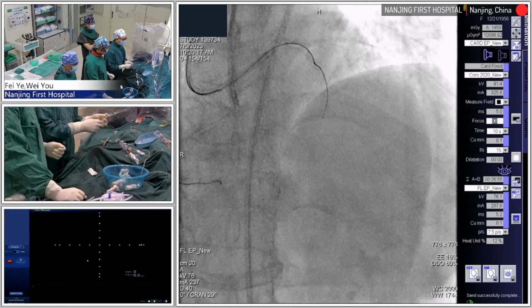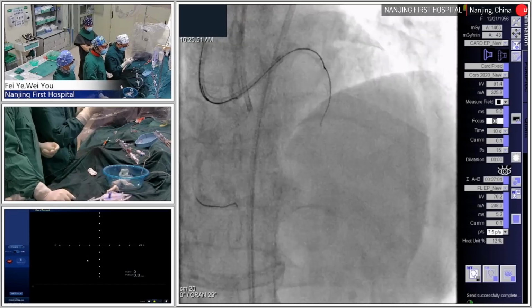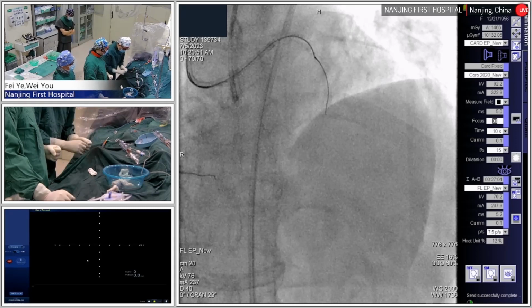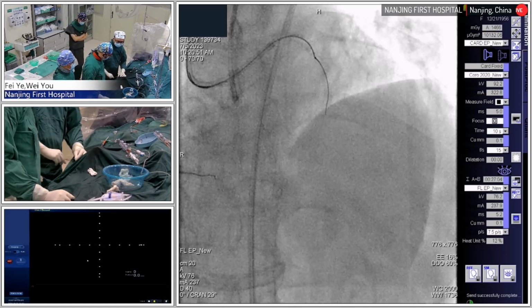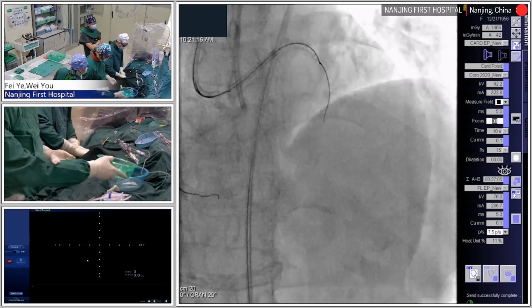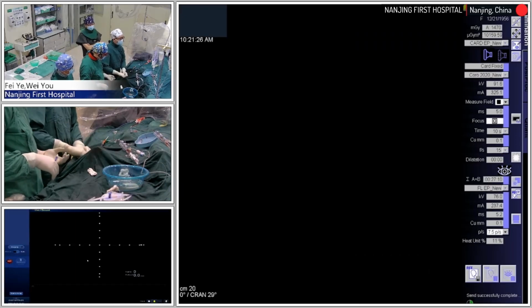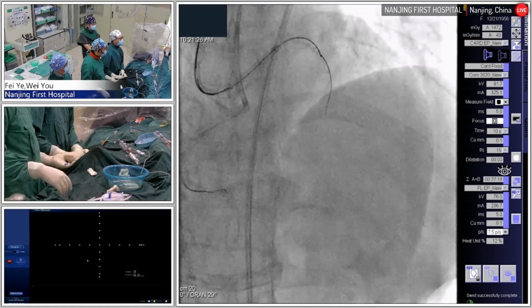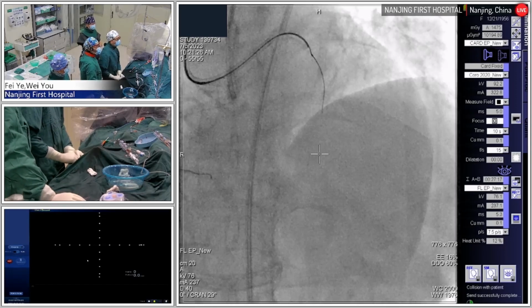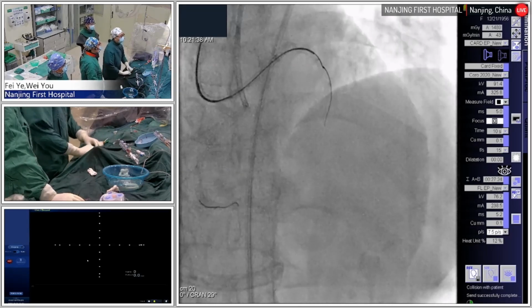Okay, as you see now, the KDL just goes here and cannot go any further. Sometimes, compared with only a single lumen microcatheter, the profile is smaller than a double lumen catheter. So the single lumen microcatheter can go more distally compared with the double channel. If there is a severe dissection, I want to use a double lumen catheter. If there is no severe dissection, from my experience, I want to use a single lumen. Just because we cannot push the double lumen catheter more distally, we don't have any benefit from it. Agree.